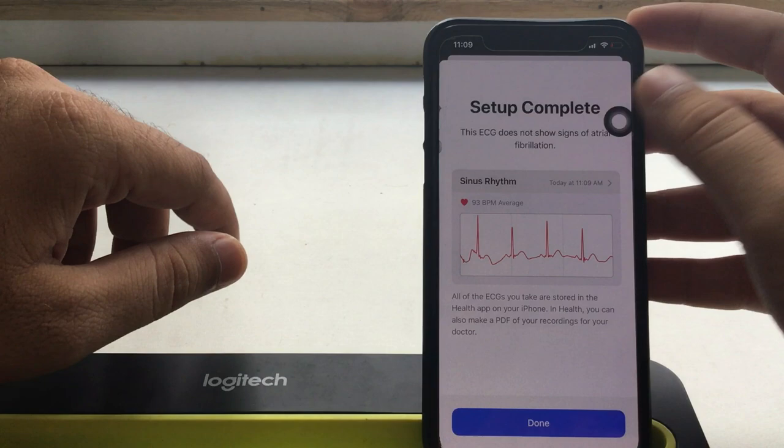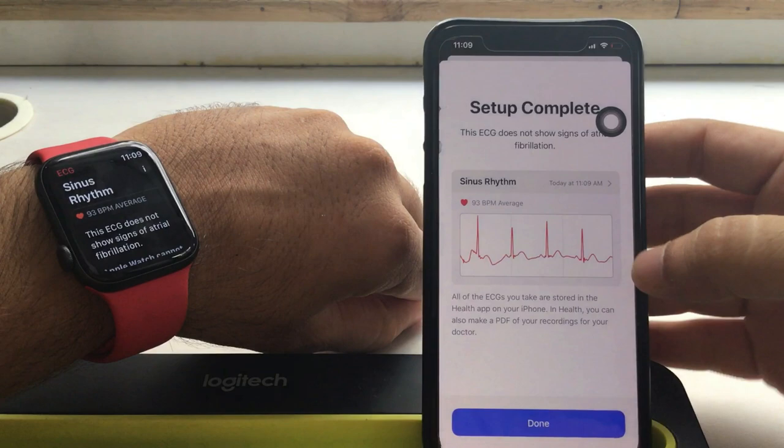Also, you can take another test after tapping on done at the bottom of your Apple Watch screen. Now I am taking another test with my Apple Watch ECG app.